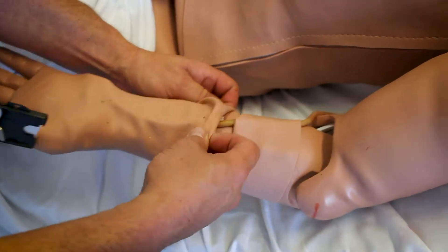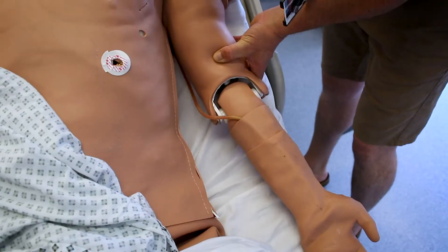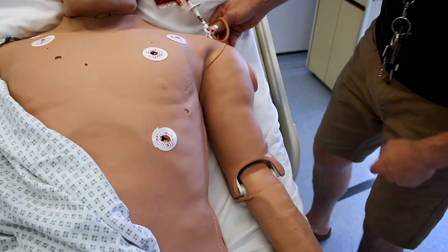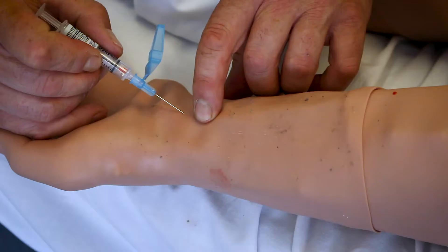Cover it over and line up. Then give it a check to see whether it's working. To increase the flashback, if you're not getting sufficient flashback, you can always put a small pressure bag on to squeeze the bag.